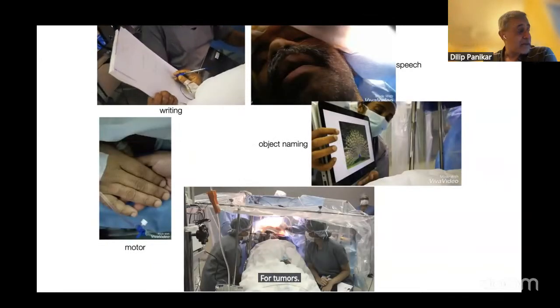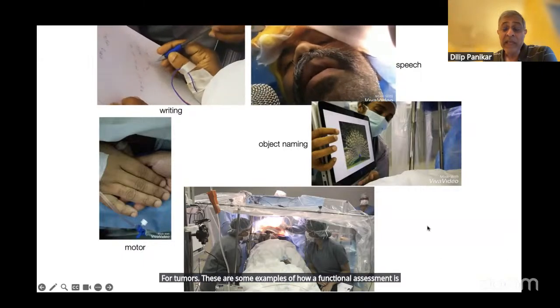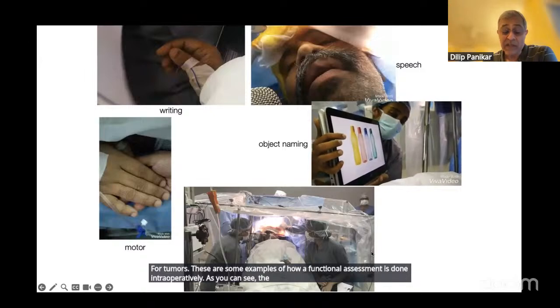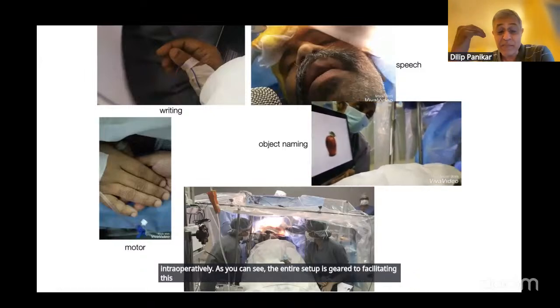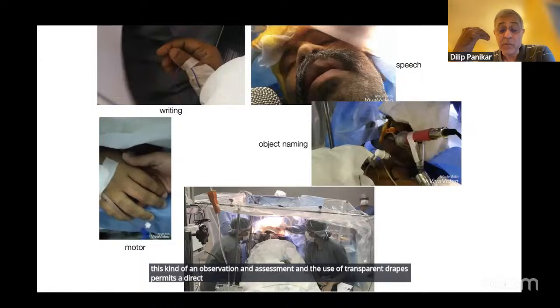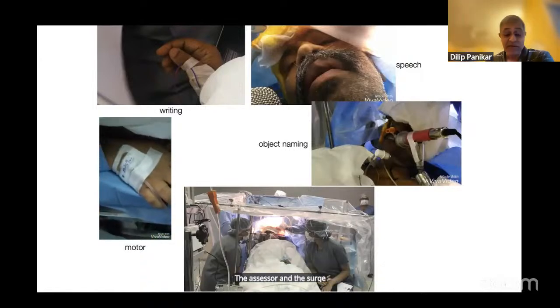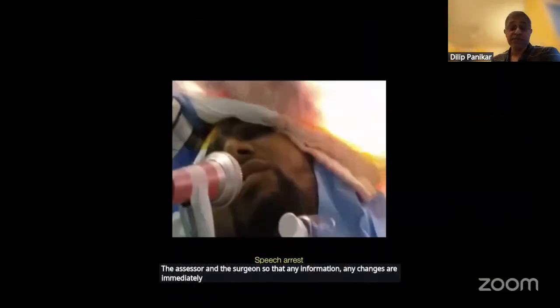These are some examples of how a functional assessment is done intraoperatively. As you can see, the entire setup is geared to facilitating this kind of observation and assessment. And the use of transparent drapes permits a direct line of sight and communication between the assessor and the surgeon, so that any information, any changes are immediately conveyed back to the surgeon.